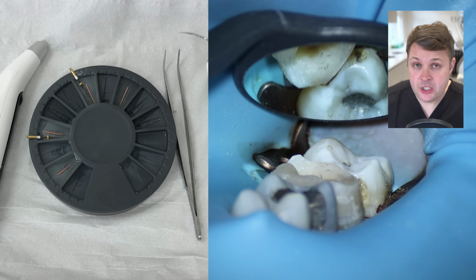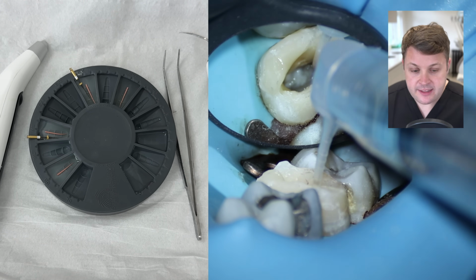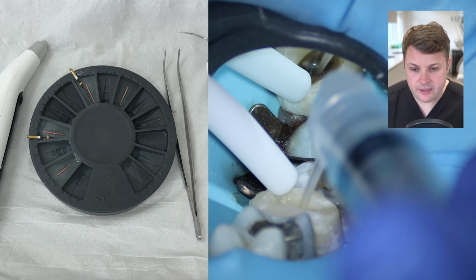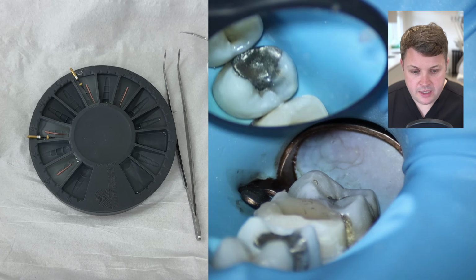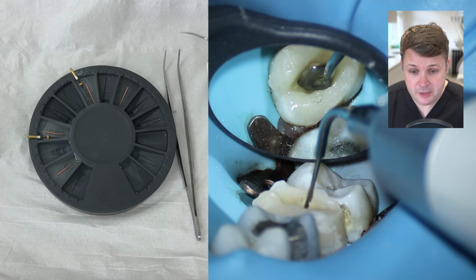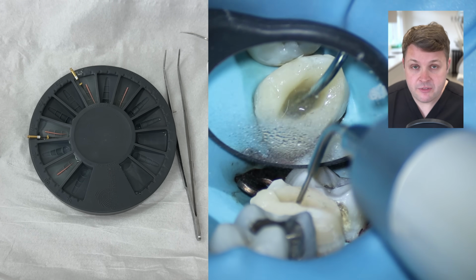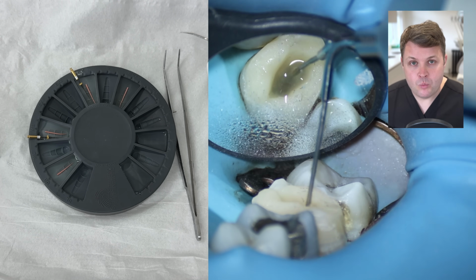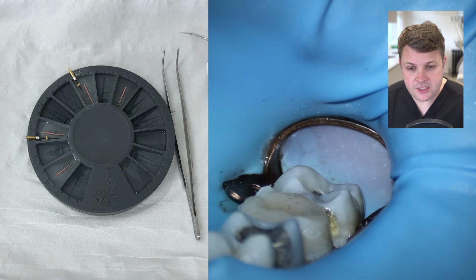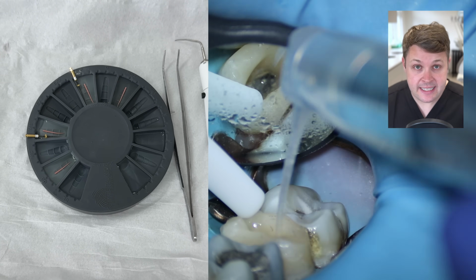In this case, I'm going to use 5% sodium hypochlorite. That's going to be activated, really important to activate, and I do that until it runs clear. Once it's activated, and this can take quite a significant amount of time, especially if there's 4 canals, we've done quite a few cycles of this with sodium hypochlorite, and it starts to run clearish. We're then ready for our 17% EDTA.